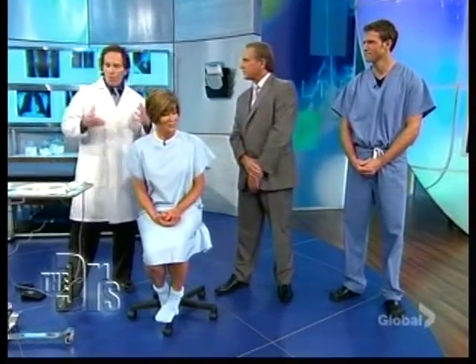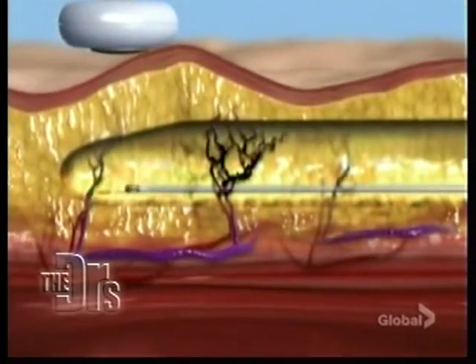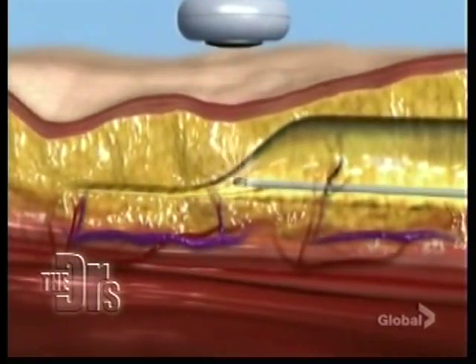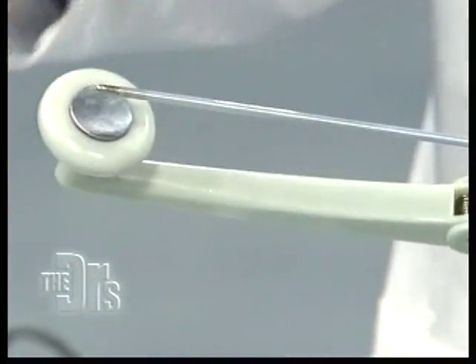So tell us how it worked. Well, what ends up happening is we're putting in an electrode that has a suction cannula attached to it. And when we put it underneath the skin, that's generating some heat and at the same time sucking out the fat. On the top of the skin, there's a thermistor, or kind of like another electrode, that's giving you the idea of exactly what the temperature is on the skin surface. And that gives us 2 good things. Number one, it's safety, so you know it's not getting really hot. And the second thing is you want to make it hot enough so that the skin actually will retract.